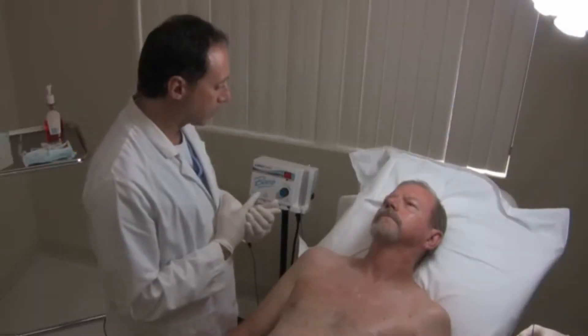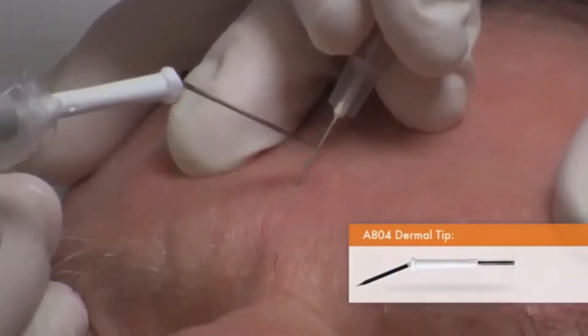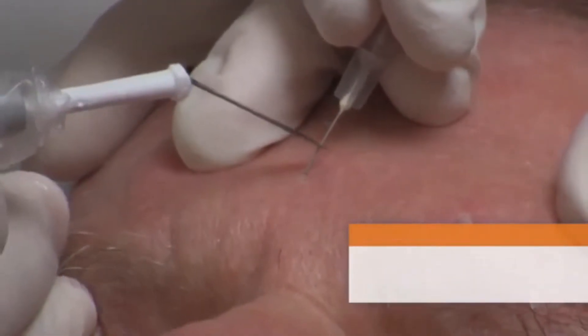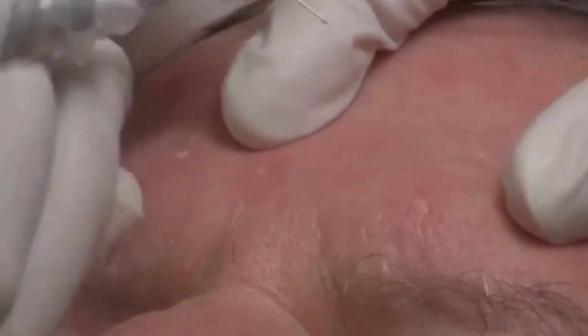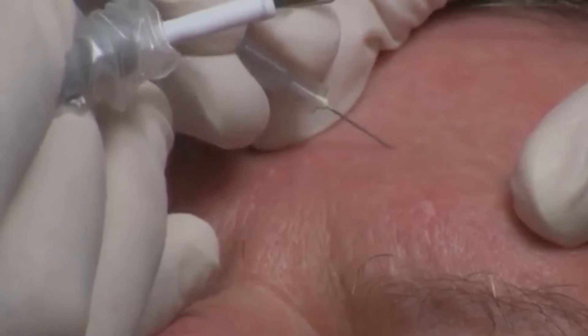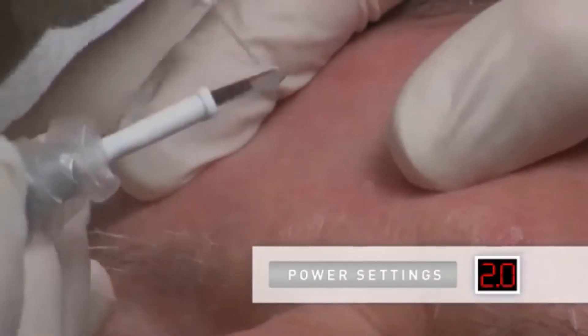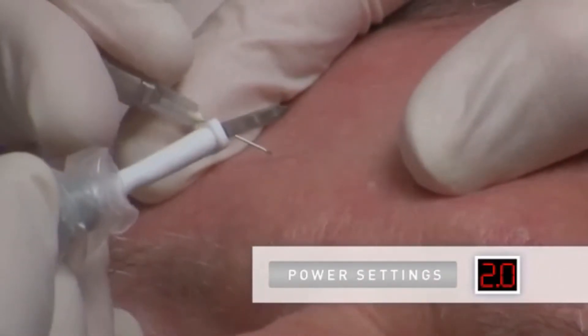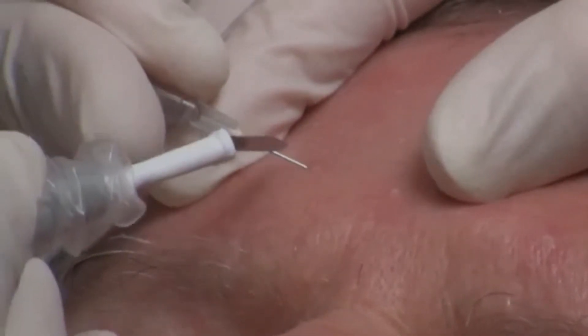The ARIN 940 high-frequency desiccator by Bovee is used with an A804 dermal tip electrode and a 27-gauge needle. Expose the area being treated by stretching the skin surrounding the lesion. Place the tip of the needle on the side of the lesion and penetrate it superficially. With a power setting of 2 watts, gently make contact with the electrode to the needle and activate the handpiece.